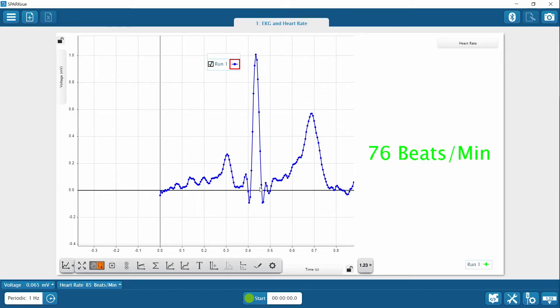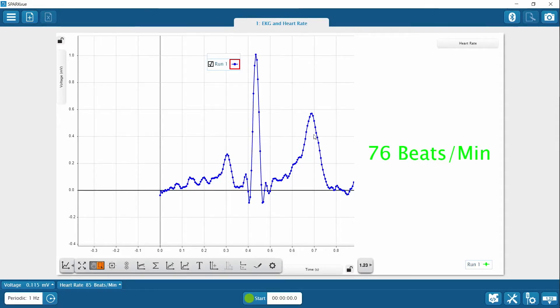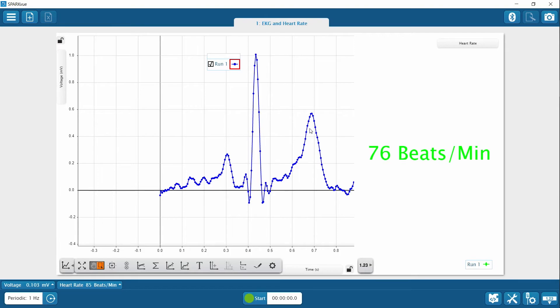Ventricular contraction continues through the S and T waves as blood is pumped away from the heart out to the body. The T wave represents relaxation and repolarization of the ventricles in preparation for the next cardiac cycle. Repolarization of the atria is hidden due to the large signal generated during ventricular contraction.